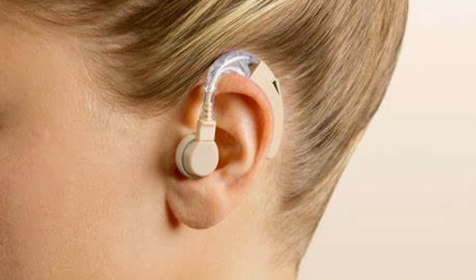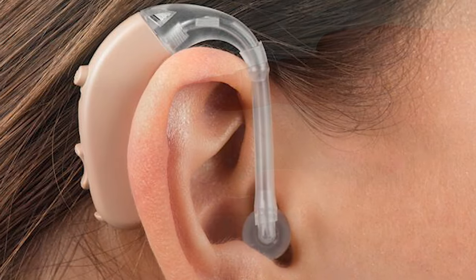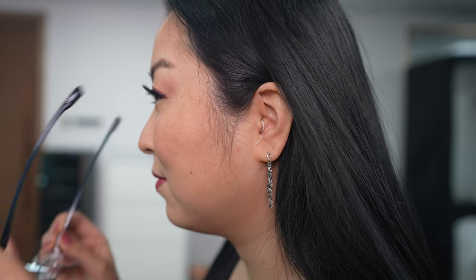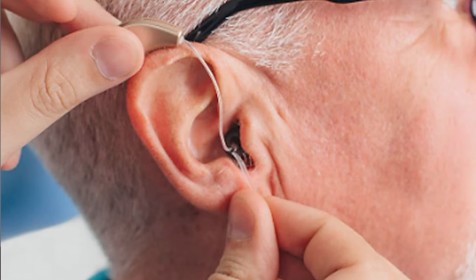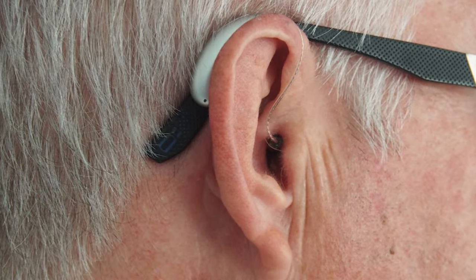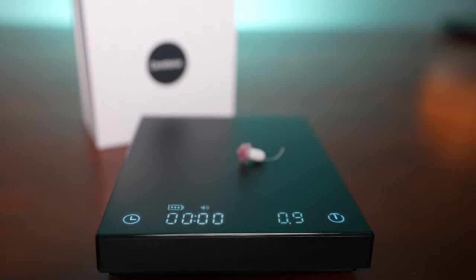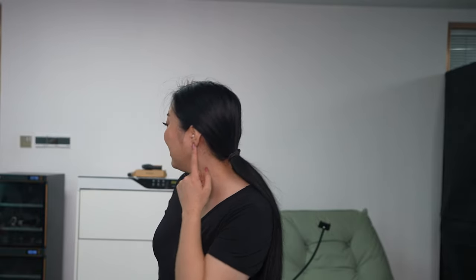Unlike normal hearing aids that are big and visible, Core One is very small and discreet — almost unnoticeable after you use it. Moreover, it's an excellent choice for those who wear glasses, alleviating concerns about fitting temple glasses and hearing aids together. With Core One, you don't need to worry about discomfort caused by both pressing against your ears through the day. They are very lightweight, weighing less than one gram, and incredibly comfortable for long periods, fitting well enough to allow exercise — you can move a lot and they will not fall.